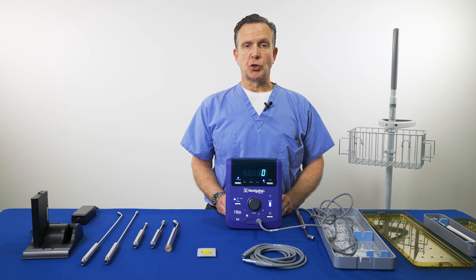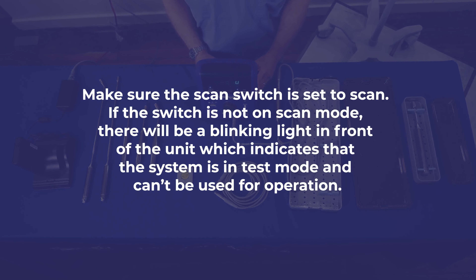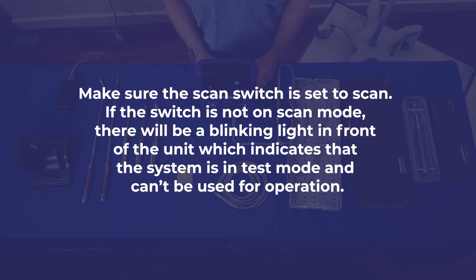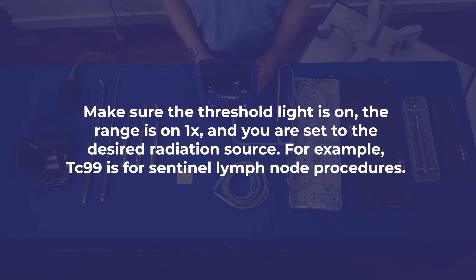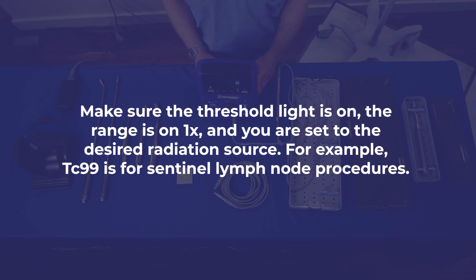Unlike some other surgical gamma probe systems, there is no long wait time for calibration, extended pairing time, or booting up. However, you can always check to make sure the settings were not changed during the previous procedure. Make sure the scan switch is set to scan — if not, there will be a blinking light indicating the system is in test mode. Make sure the threshold light is on, the range is on 1x, and you are set to the desired radiation source. For example, technetium-99 is used for sentinel lymph node procedures.